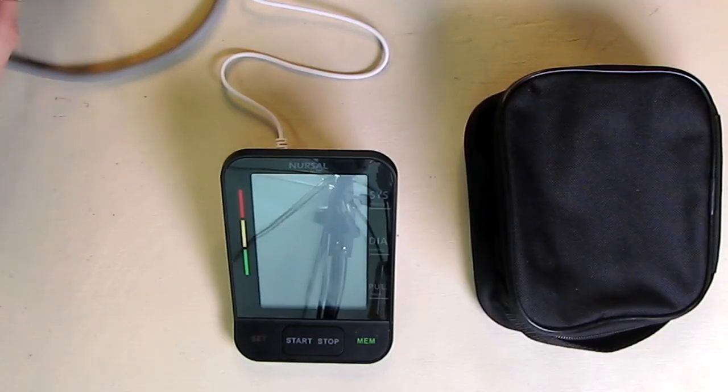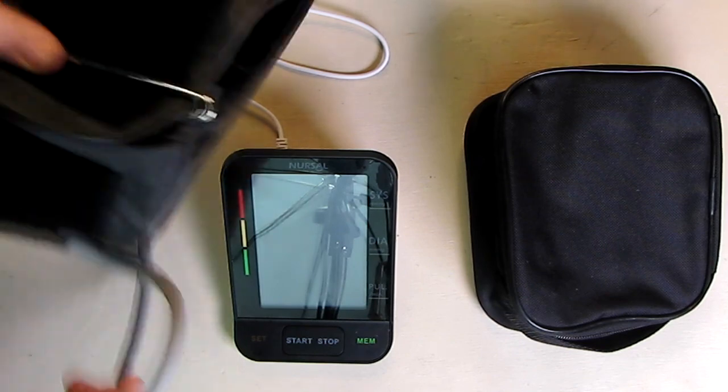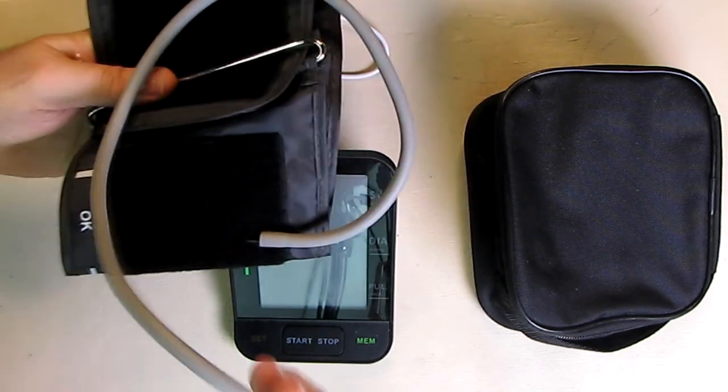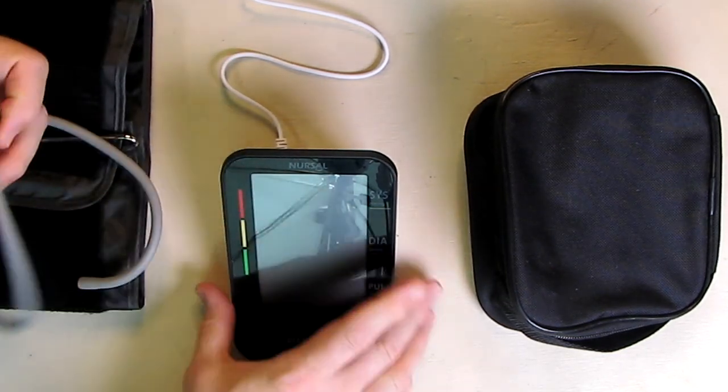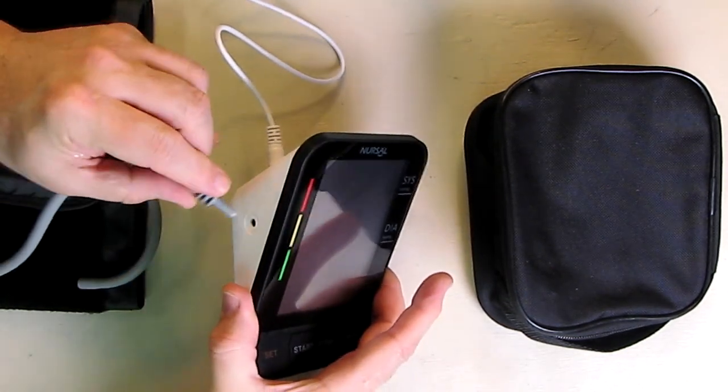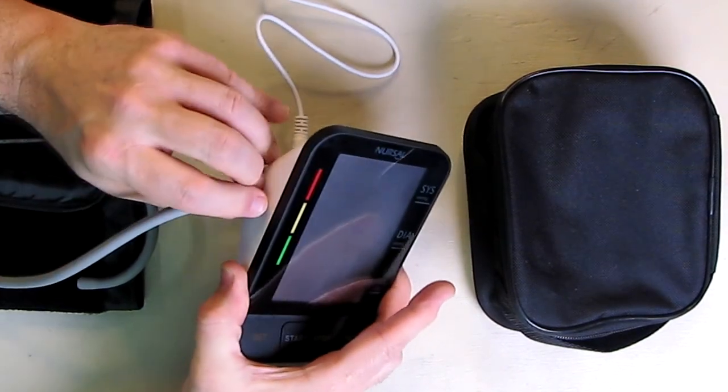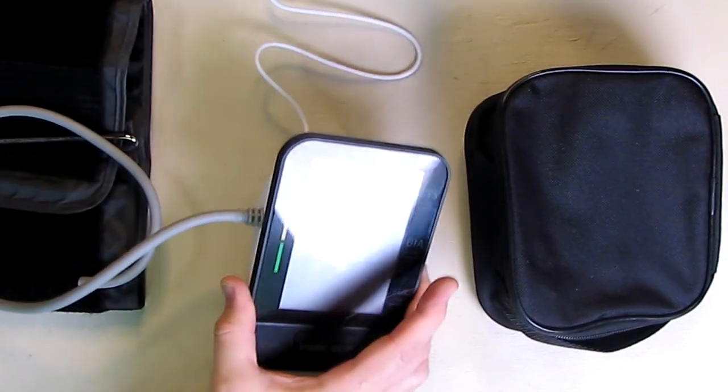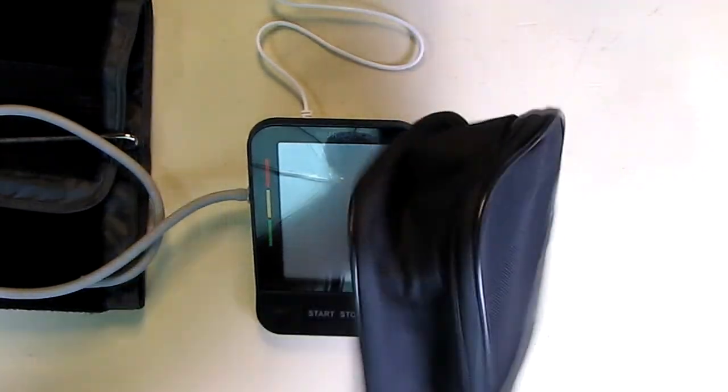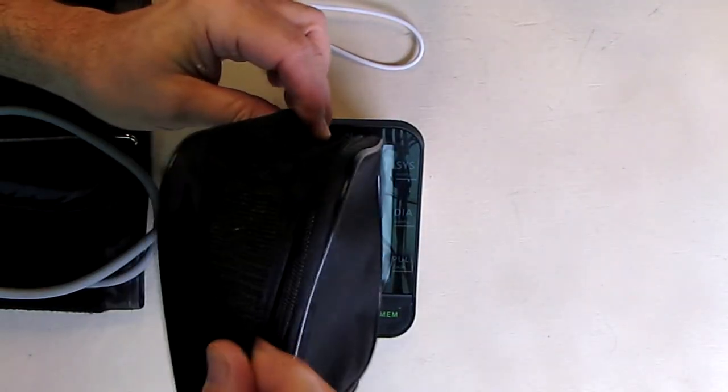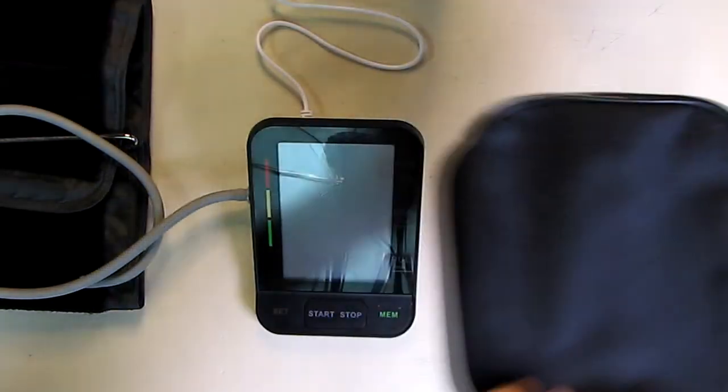The cuff itself has its vacuum attachment right there on the back, and that goes simply right on the side right here. It's a pressure fit, and it just goes right in. Simple as that. The carrying case is nice quality with a zipper and a nice little handle.